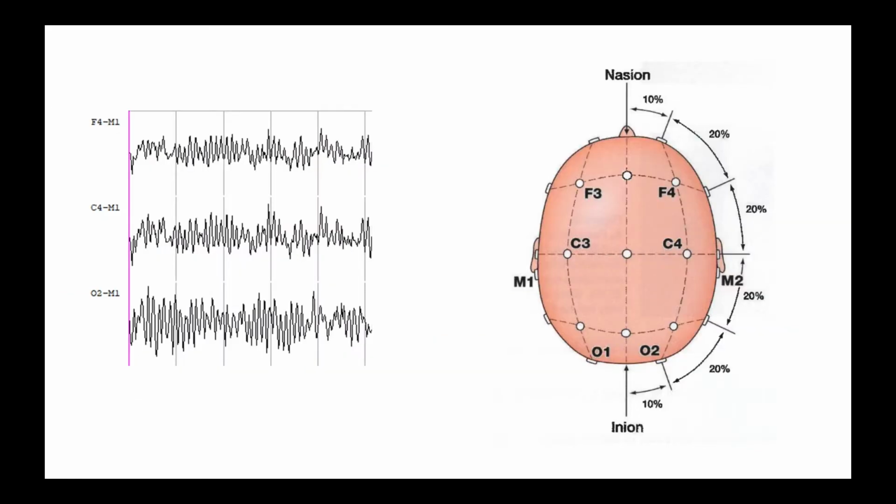Let's talk about EEG. In the 1960s, Rechtschaffen and Kales, two researchers, noticed that if you looked at brainwaves during sleep, there were some discrete patterns, and so they called these sleep stages depending on what patterns they were seeing in the EEG. And conceptually, it's largely the same today. There have been some changes. We've standardized the way we do EEGs a little bit differently, and the sleep staging has changed a little bit. But for the most part, since the 1960s, it's been the same in that we're just looking for patterns in brainwaves that correlate with what we understand about sleep.